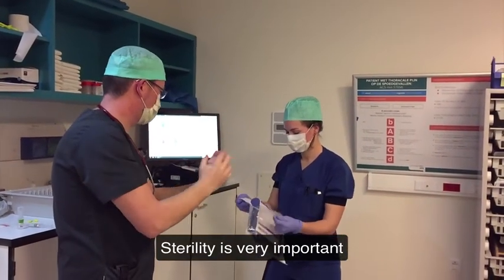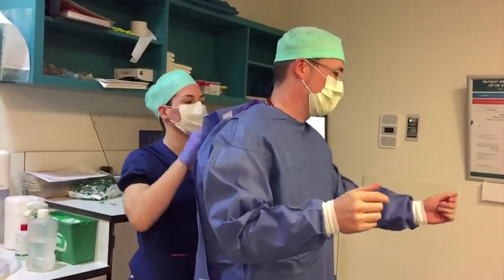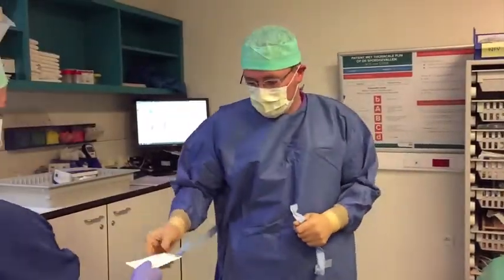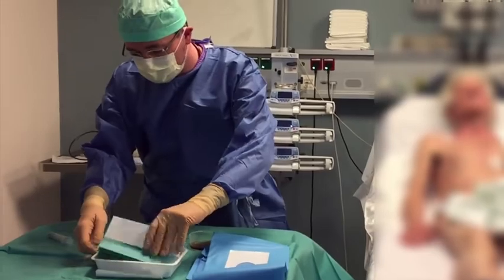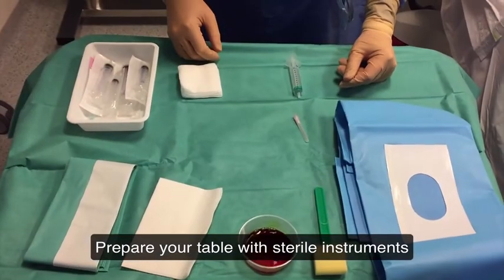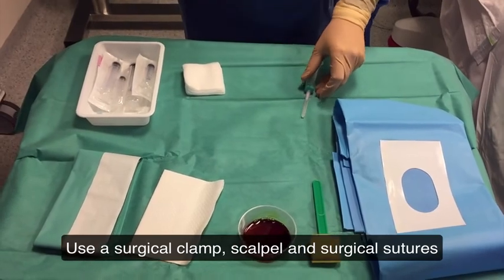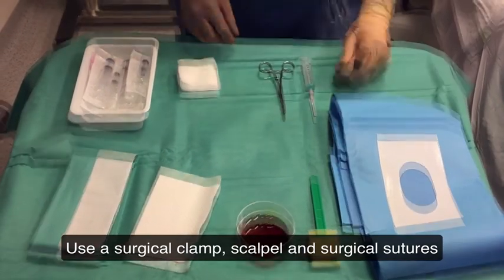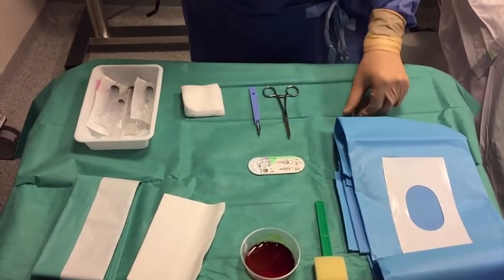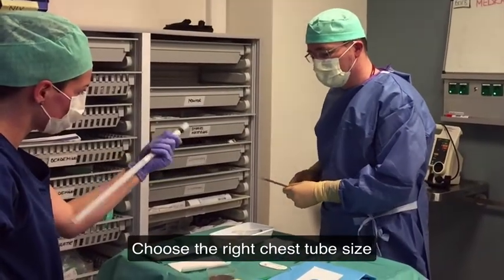Sterility is very important, so make sure you know and follow the standard operating procedures of your hospital. Prepare your table with sterile instruments. We'll be using a surgical clamp, scalpel, and surgical sutures. Use lidocaine 1 or 2% and determine the right chest tube size.